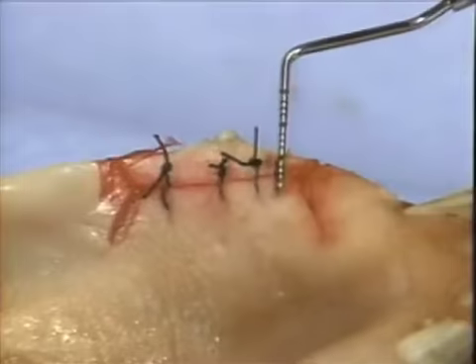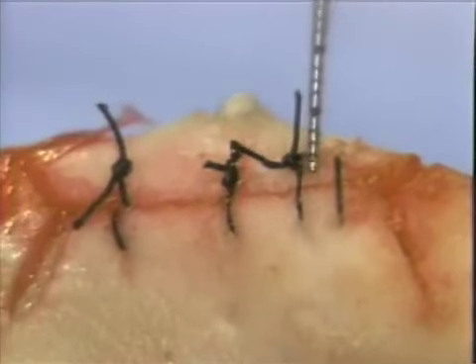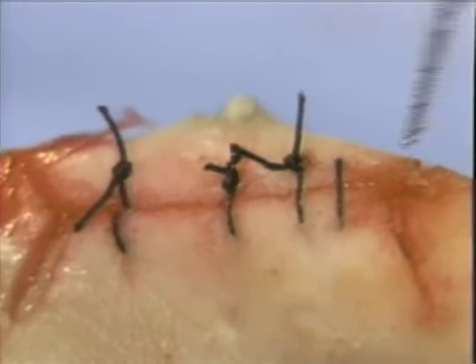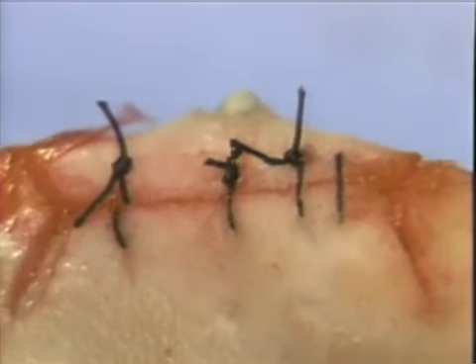These three suture techniques can now be compared. First, the horizontal mattress on the right, the interrupted loop in the middle, and the figure 8 suture on the left.